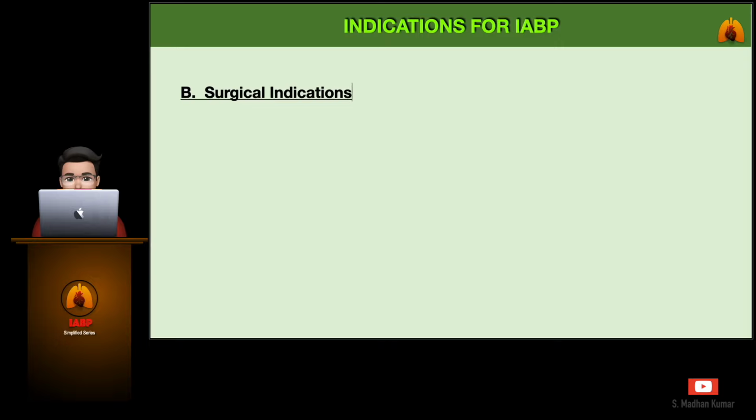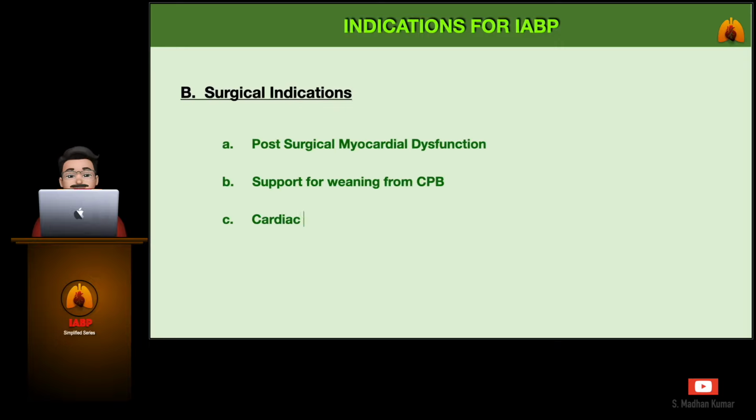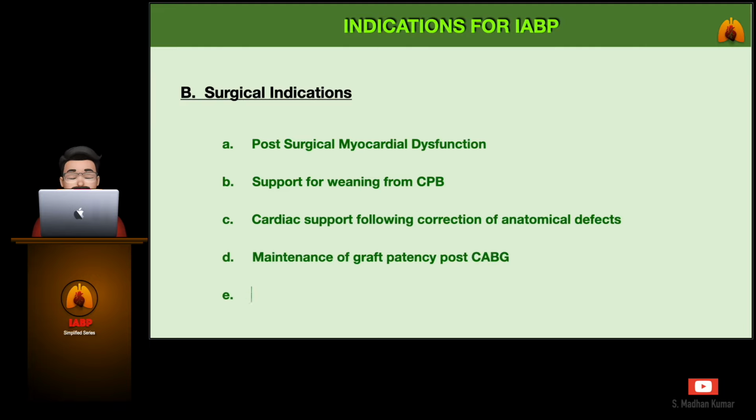The surgical indications include post-surgical myocardial dysfunction, support for weaning from CPB, cardiac support following correction of anatomical defects, maintenance of graft patency post-CABG, and pulsatile flow during CPB.